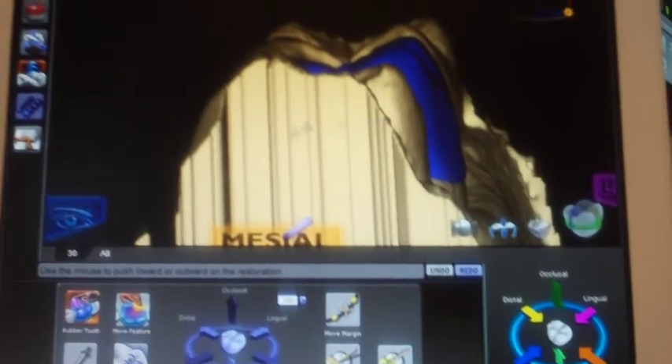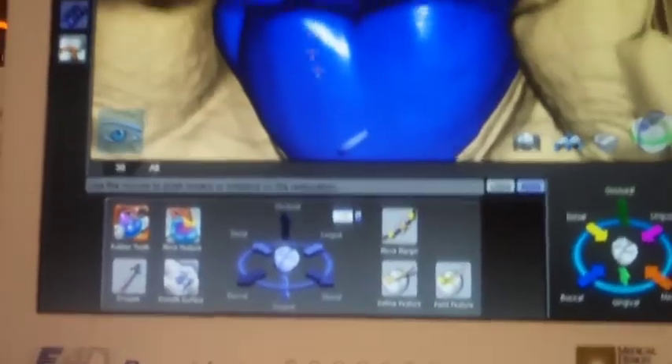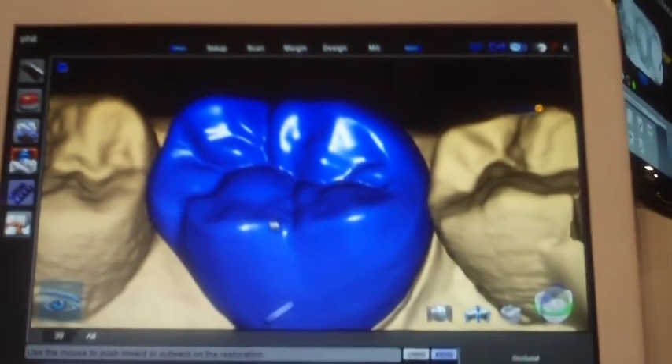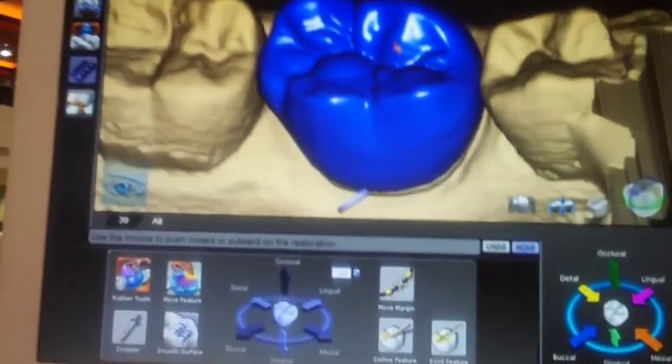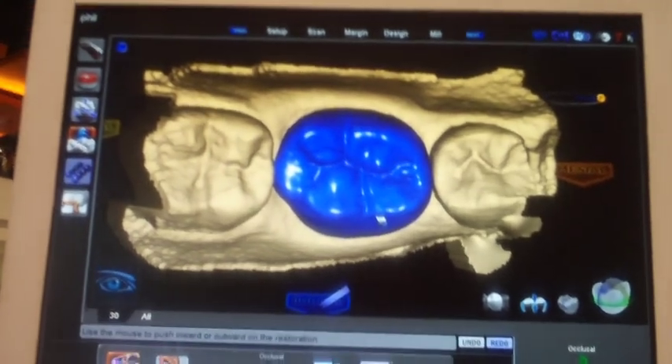So at some point we've taken an impression of the bite registration. I'll show you in an example after — I normally have a bite to put on here to scan it. I'll show you in an example how it actually works, because that's important — that's how you get your occlusal contacts. So let's say we're happy with this restoration.